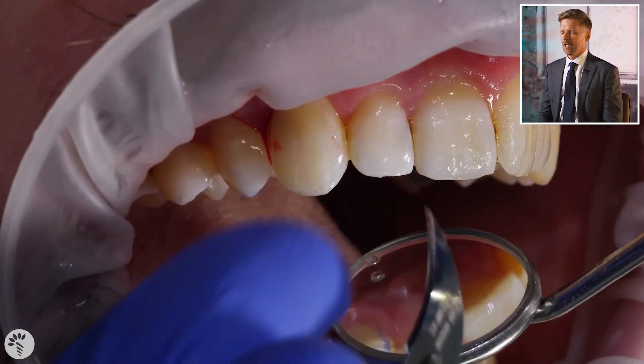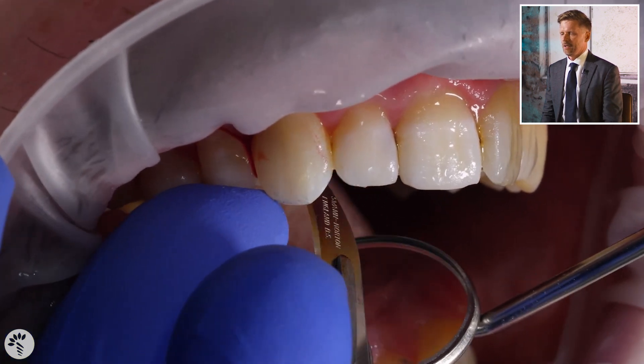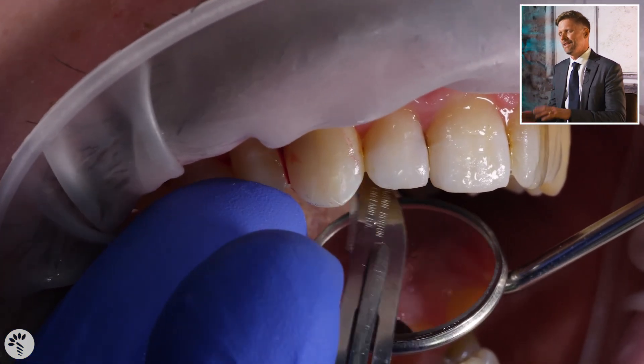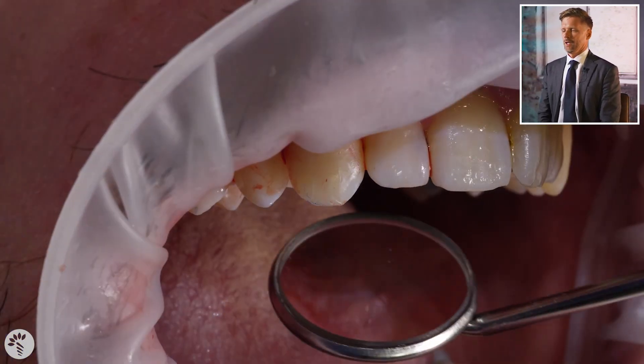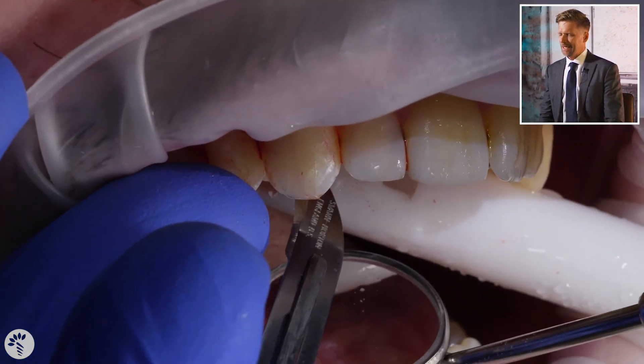Now I'm being absolutely certain that there's smoothness at the gingival margin. You can check with floss, by blowing air in to retract the tissues so you can see it, or by checking with your probe. I don't really care if it bleeds or if you traumatize the tissue at this point — it must be smooth, otherwise the tissue will be traumatized forever. Here I'm flossing to check any little areas around that.